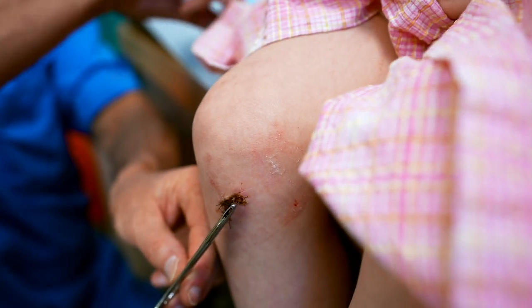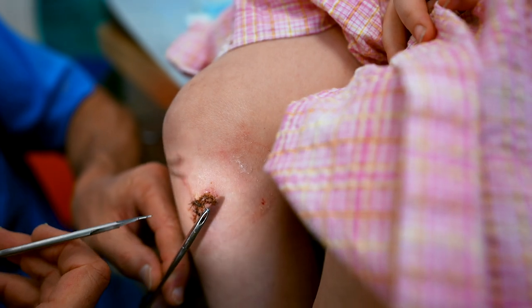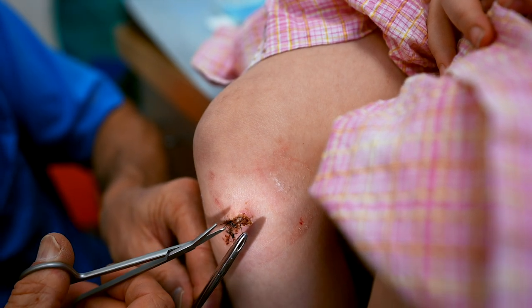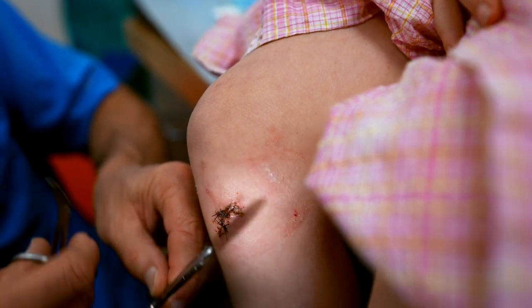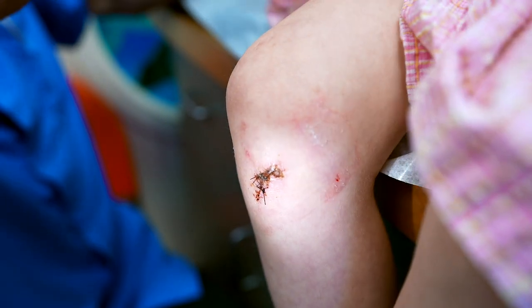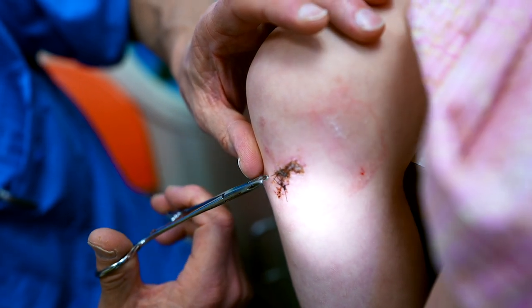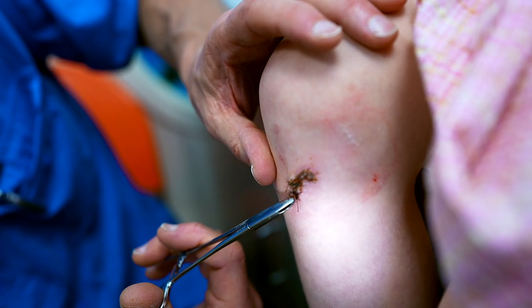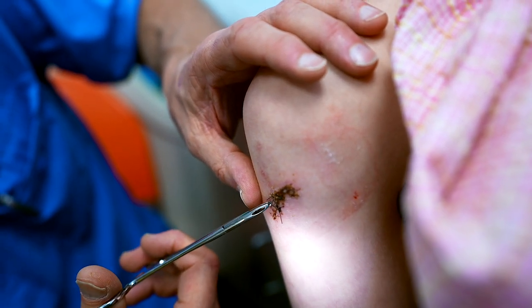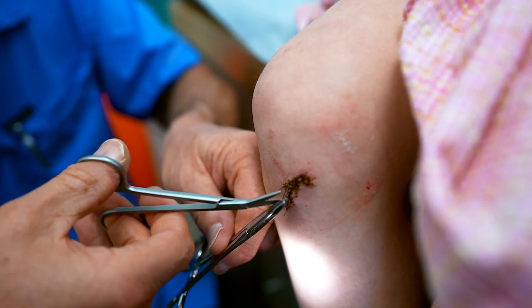Is that how many there are? Eight? Do you think there's eight? Get the light a little closer for me. How you doing up there? You still good? Yeah, you're doing great. It's starting off the loop. When my stitches come out or something like that and they get a little nervous, I guess I'm sweating. That's normal. You're being so brave.